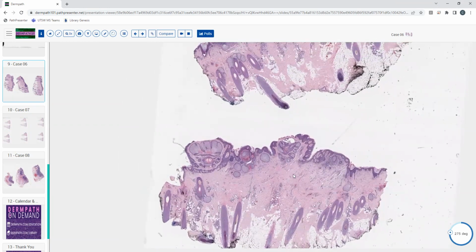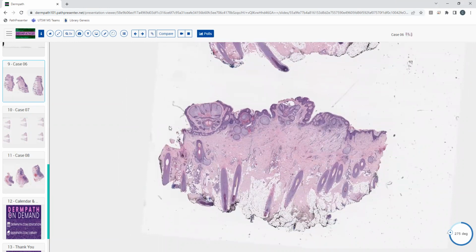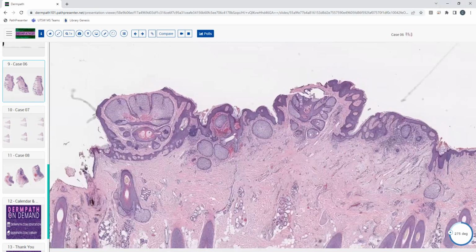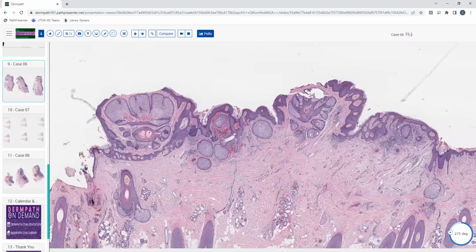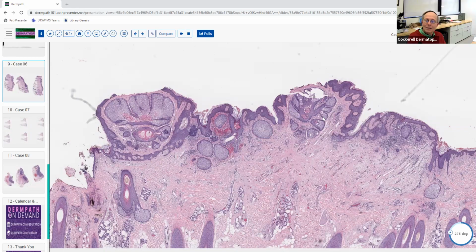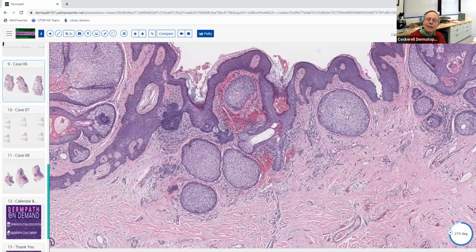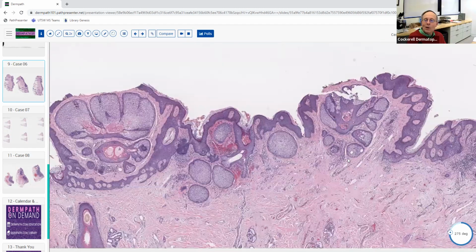Okay, this is another scalp. The follicles look like they're more in the subcutaneous fat this time, but this guy's got plenty of hair. He has what looks like a bunch of more sebaceous glands on his scalp, at least from this power. Anything peculiar about the sebaceous glands? They're quite large. They are. And notice that some of them are kind of like rogue. They're not opening up to anything. They're kind of sitting there on their own. And here's about 4 or 5 coming off this funny looking follicle.